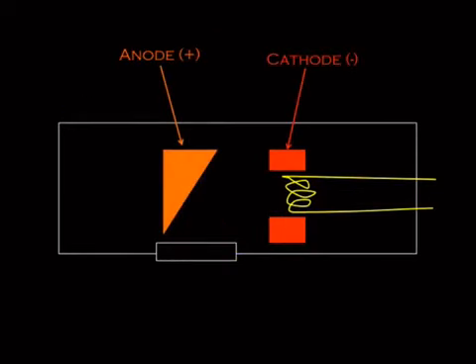So another difference is that in a standard diagnostic tube, you've got a window here, and that is just made out of Pyrex glass. That's not used in mammography because it causes excessive attenuation, especially at those lower energies. And those lower energies are the ones that you want to use in mammography. So they use a beryllium exit window instead. So there, something like that. I'm going to keep those lower energy X-rays.